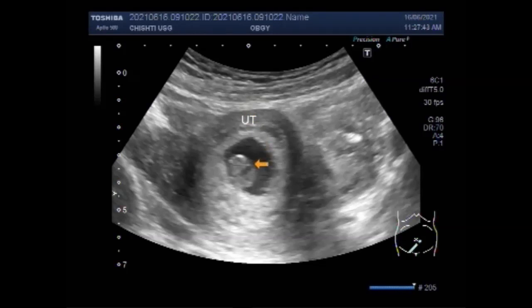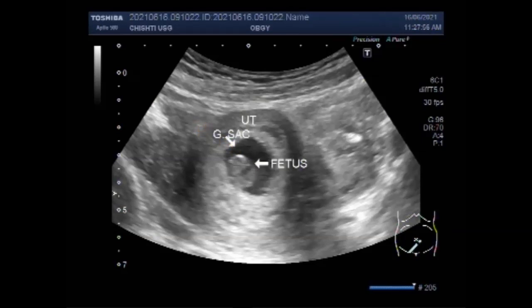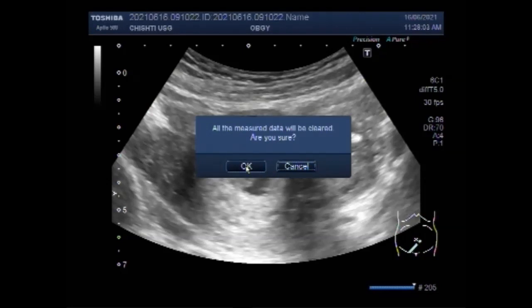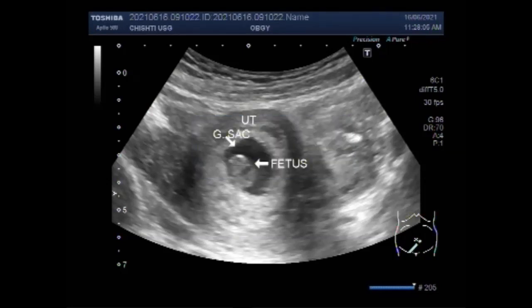You can see the fetal pole in the gestation sac. Ultrasound diagnosis of miscarriage should only be considered when either a mean gestational sac diameter of equal to or more than 25 mm with no obvious yolk sac, or a fetal pole with a crown-rump length of equal to or more than 7 mm without evidence of fetal cardiac activity.